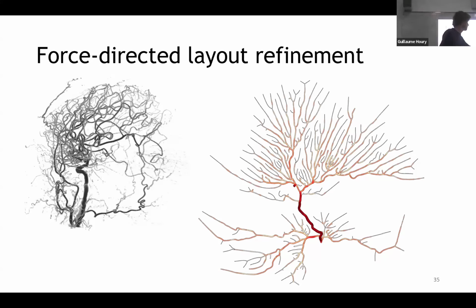And for instance, we clearly see the aneurysm here on the 2D representation, which is quite hard to read on this image. So we have it here. Of course, by turning around, we will see it clearer, but the point is that having a 2D representation makes things way more visual.